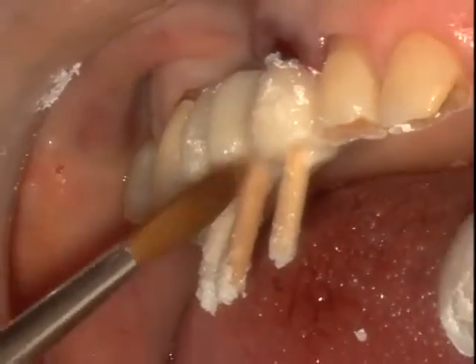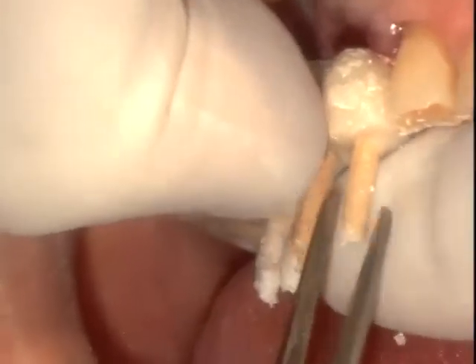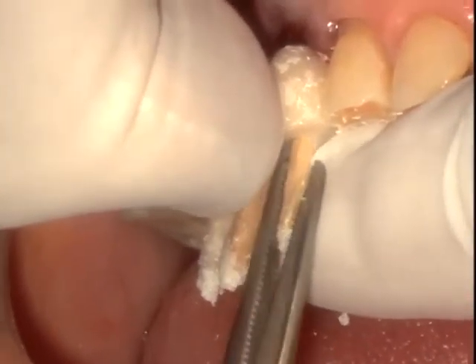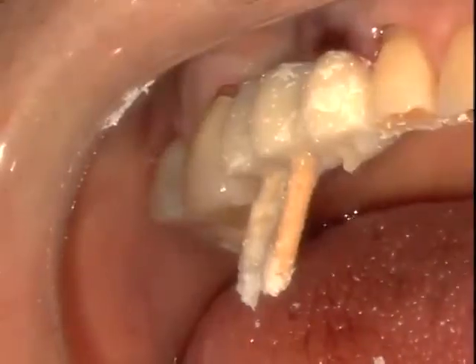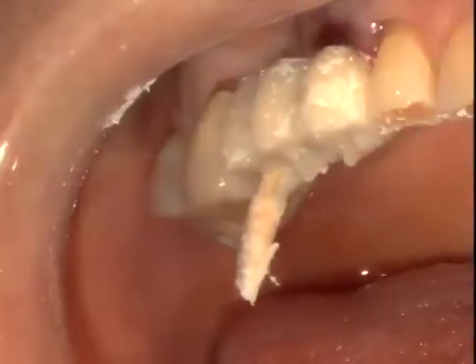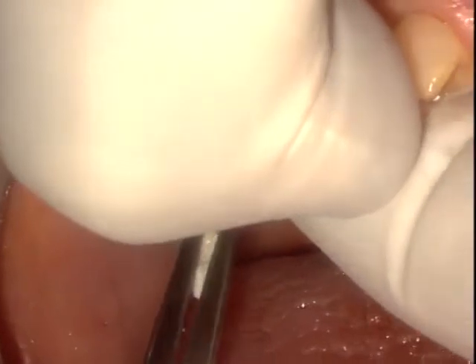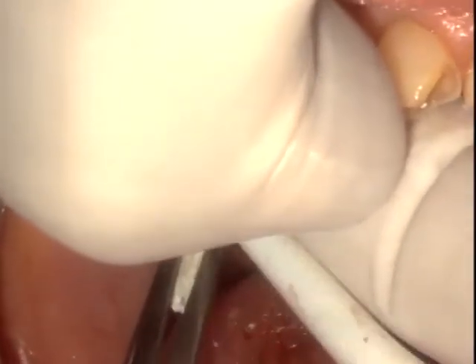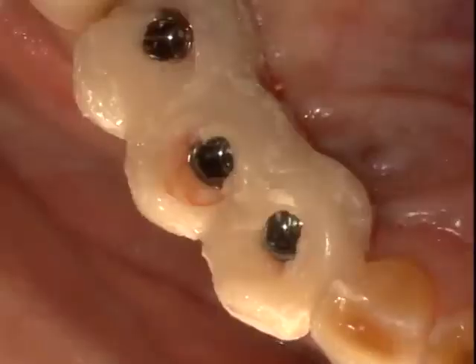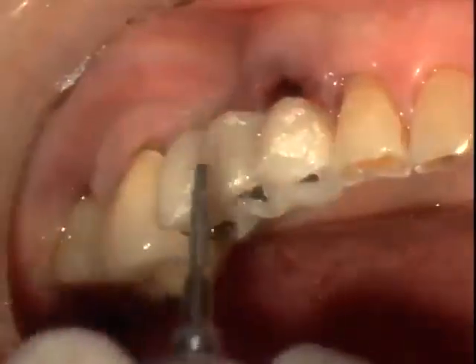It's a little trick that I have learned from David Garber, and these can be sticks that are the back ends of an applicator or a cotton swab. And you can see we take it out before it completely sets. We had placed the lubricant on these wooden sticks, so removal of them towards the end of the setting time of the composite or acrylic resin allows for easy removal of these cotton swab wooden sticks, now leaving us with perfect access to the screw channels.